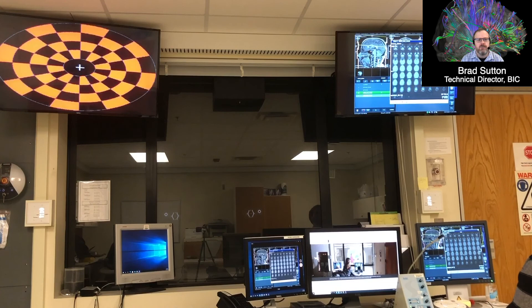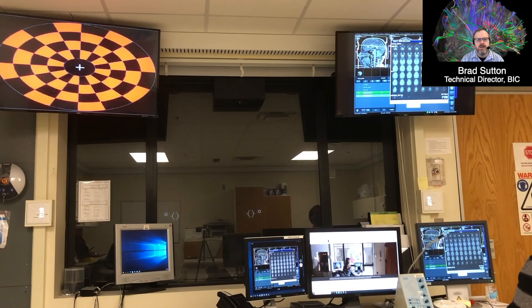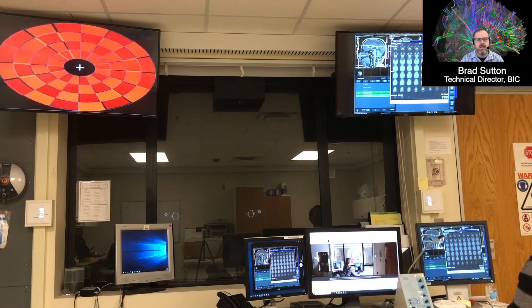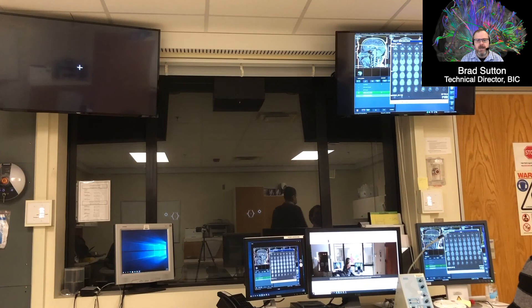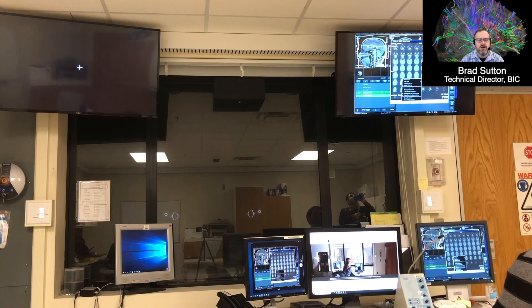Even a slight motion will move the brain a little in the scanner. The subject is just lying on a pillow, so shifting hands around can move the head. While the flashing checkerboard is on, they'll tap their fingers on both hands as fast as they can — thumb against the first, second, third, and fourth fingers, then back again. Doing this with both hands means both sides of the brain's motor cortex — the part involved in muscle movement — will light up.